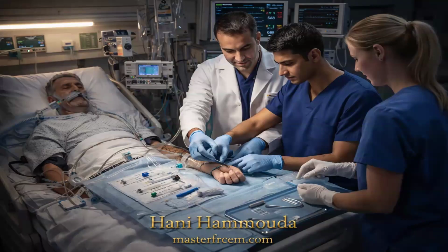Talking about the contraindication, if a patient has a coagulopathy, he wouldn't be moved to go and cannulate the artery because of severe bleeding. If the patient has absent collaterals, that is, if the ulnar artery is not palpable, it's advisable to stay clear of that particular site. And if there is cellulitis infection at the site where you want to cannulate the vessel, of course, you have to avoid that.